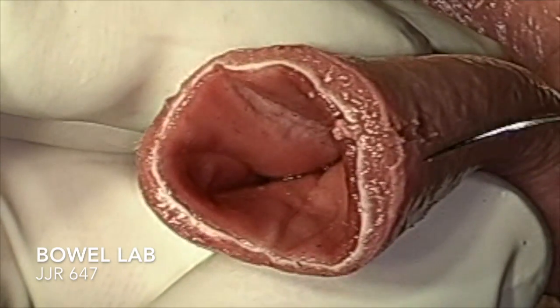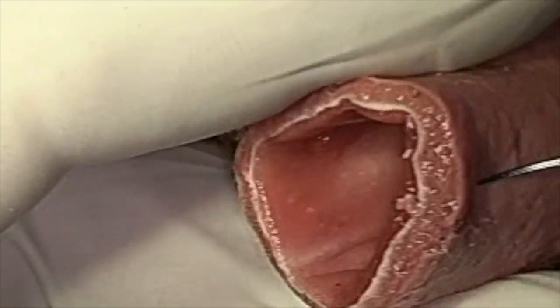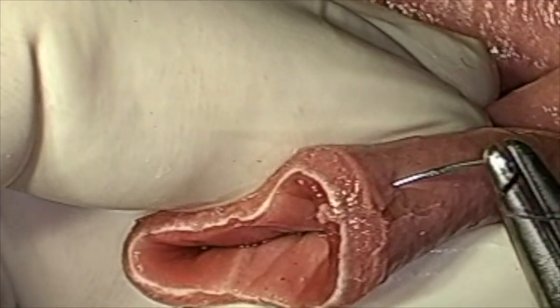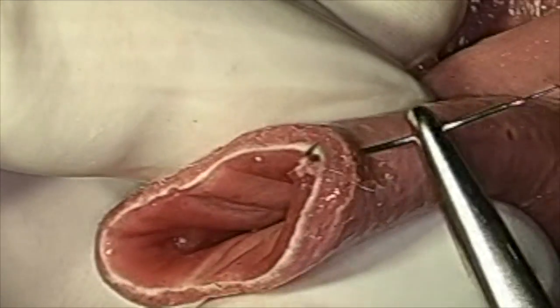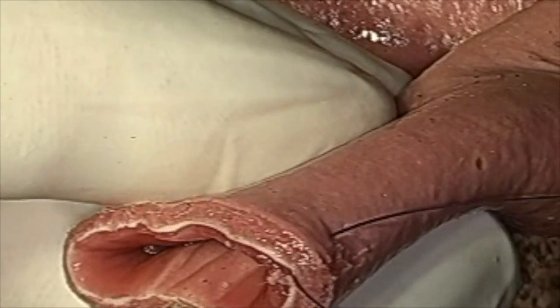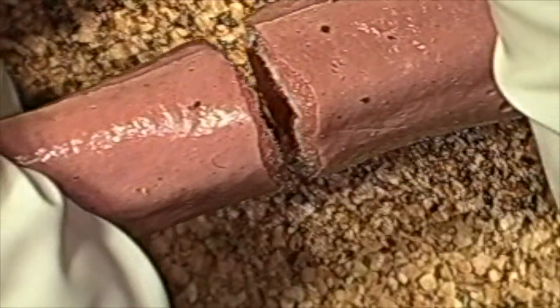This will be the segment that talks about how we're going to do our RNA, or resection anastomosis. This bowel has a very nice line resembling the submucosa, so we're going to utilize that for our attempt at a modified Gamby. One can definitely do a full thickness bite as well, but it's always most important to ensure that we are getting the submucosa.